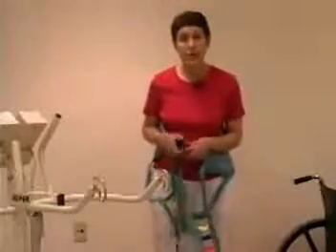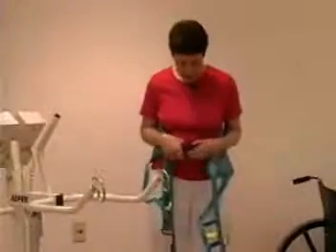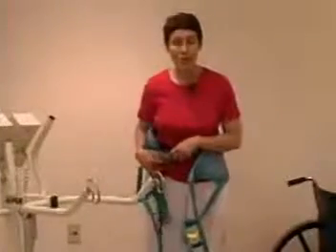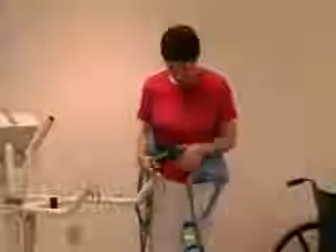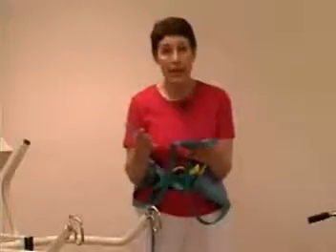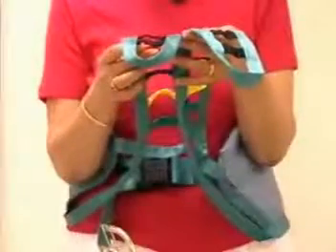When you secure the safety strap, you don't have to make it too tight, but you should just make it secure so that it's not going to slip too much. At the ends of the slings are some color-coded loops, and the purpose of the loops is to allow you to bring the patient close to the lift or keep the patient further away from the lift depending on the patient's size as you're using it.